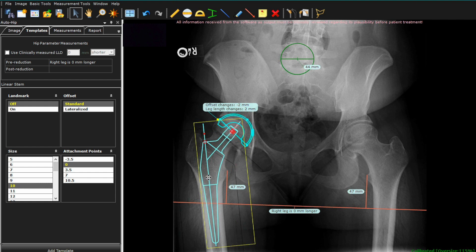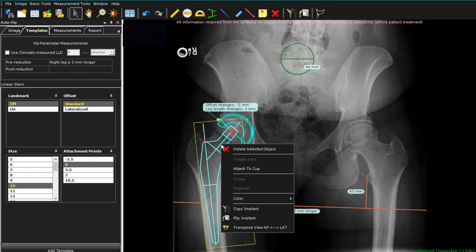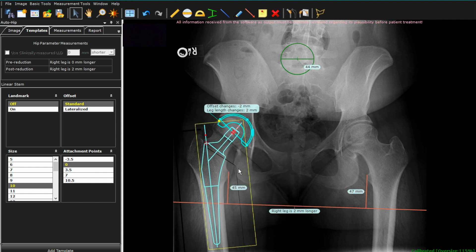I'm now going to use a feature called attach to cup, where you right-click and hit attach to cup. Now the red dot of the cup and the red dot of the stem are going to meet each other, as if you've done a virtual reduction of the hip joint. The nice thing about this is it allows you to see what the change in leg length and offset is going to be with that combination and position of implants. In this case, there was very little change based on the fact that there was really no leg length discrepancy and very little change in the offset.